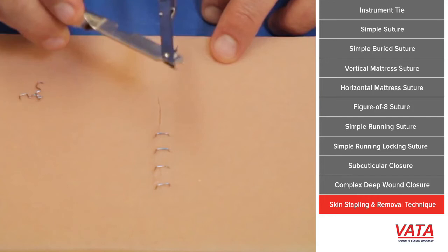Now, doc, how do we do this in a live dog? You can with proper restraint. You could sedate a little bit. Okay? This is without the staple remover. You could use a needle holder. But then again, see, it opens the wound a little bit as compared to the other one.